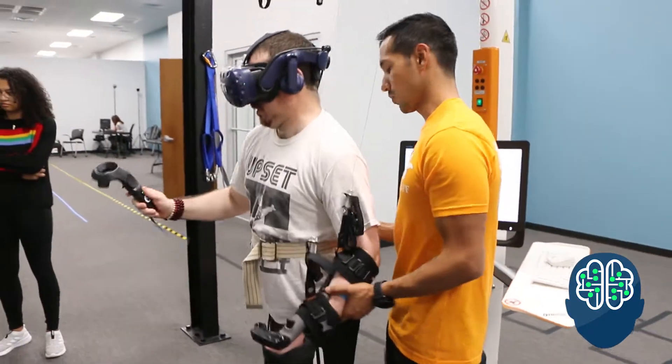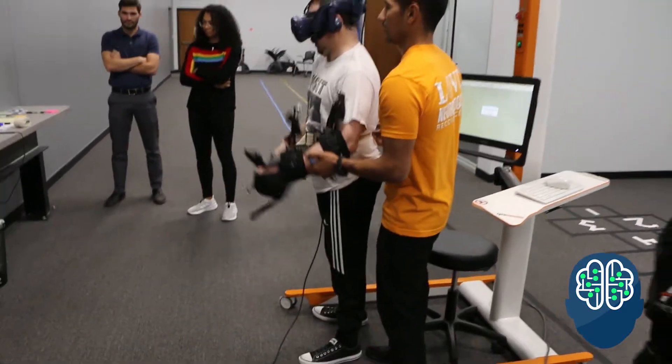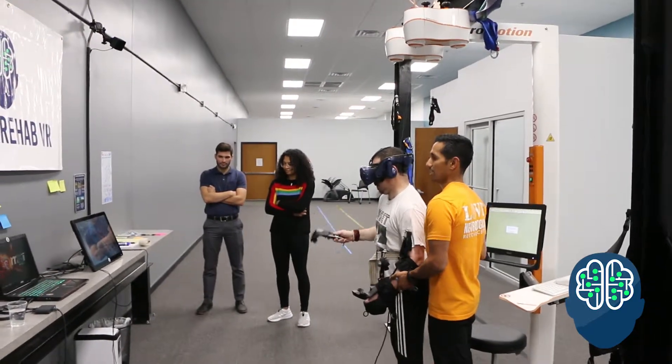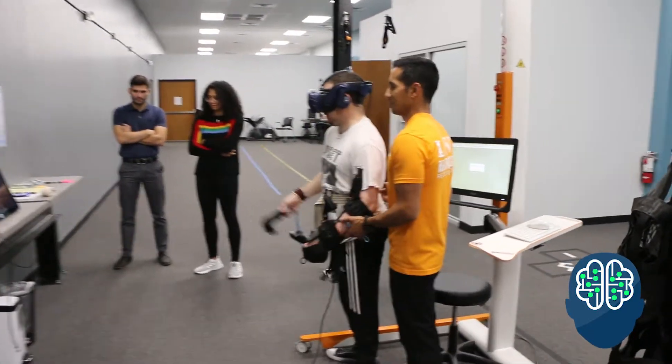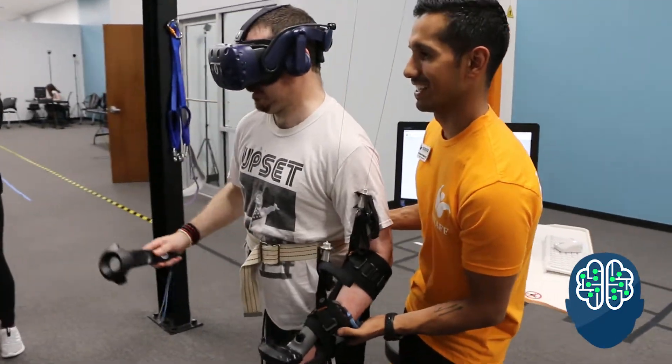We're also working on the standing balance — that's what's good. That's really good. We've used it a couple times and we really like it. Matt loves it. I like it too.